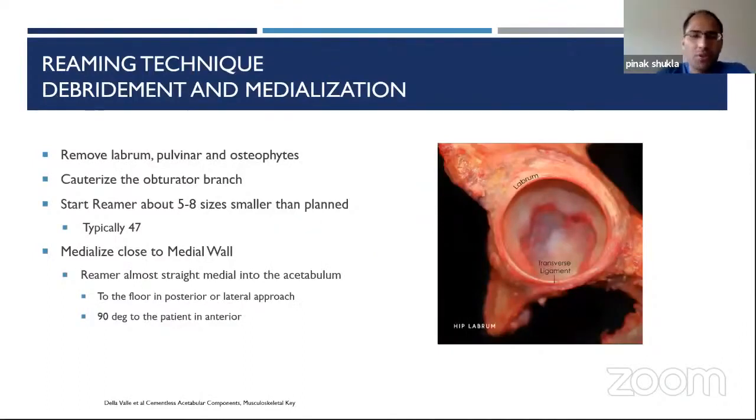Now with retractors and exposure in place, we remove all soft tissues. In an anatomic specimen you can see the labrum, transverse acetabular ligament, and once the pulvinar is taken out, the floor of the cotyloid fossa. We remove the labrum and pulvinar, cauterize the obturator branch down here, and then we can start reaming. Generally, many women end up around a 54 cup and many men around a 56 cup, plus or minus two. Start somewhere around five to eight sizes smaller — I'll typically start around 47.